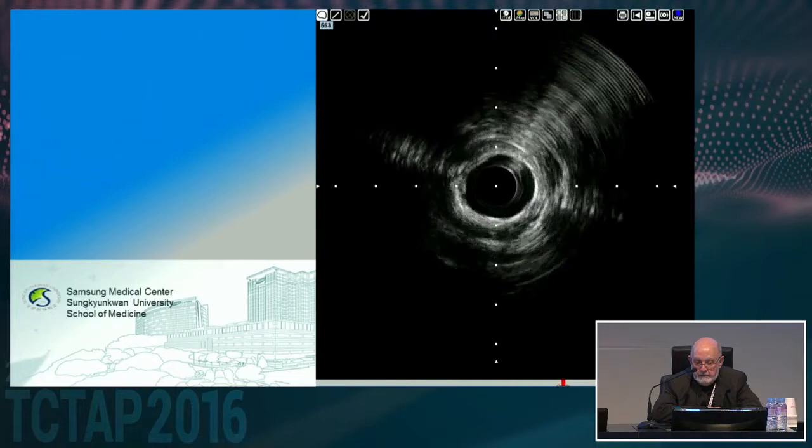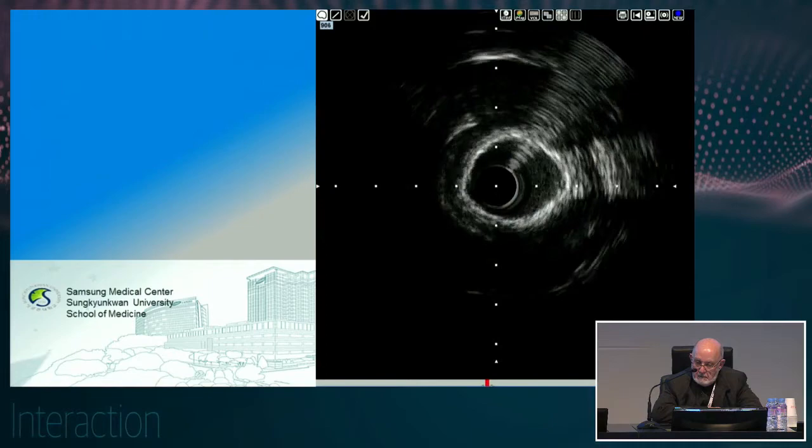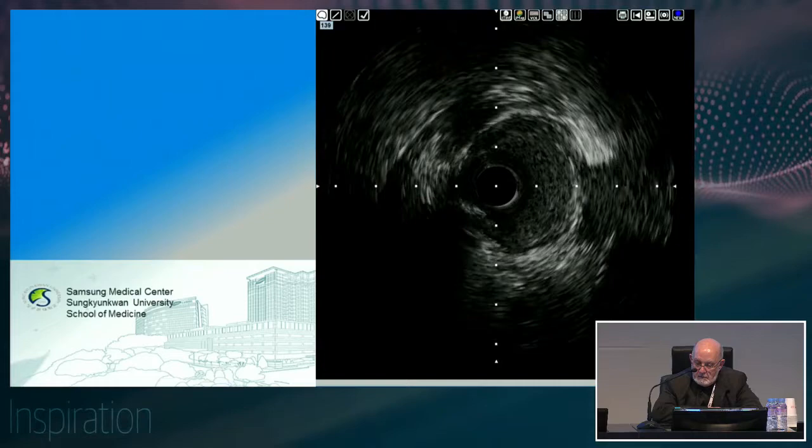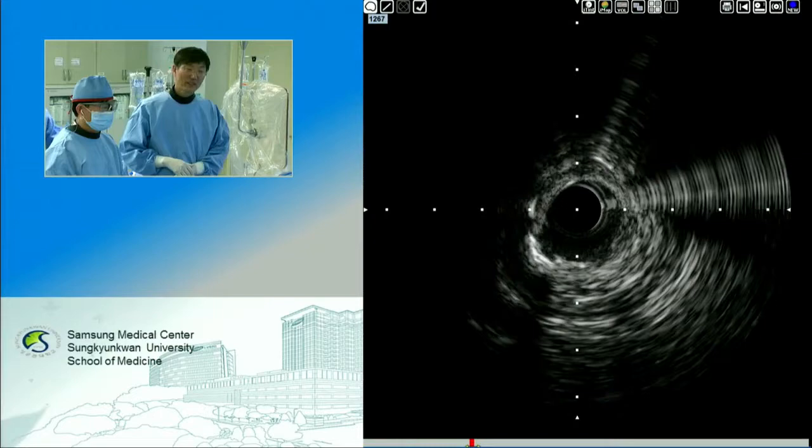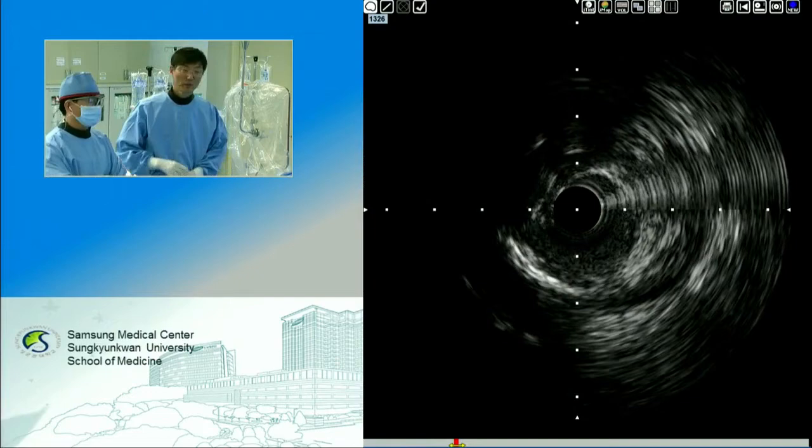So my question is, do we need to upsize the rotaburr? Distally, this is size 3.0, but it's not clear in this IVUS, but still the vessel size is larger than 3.5 in the proximal LAD, and there is a very huge napkin ring, more than napkin ring, 360 degree calcification, and I'm not sure we can have an optimal stent expansion proximally without upsizing the burr. What's your opinion, Dr. Park?